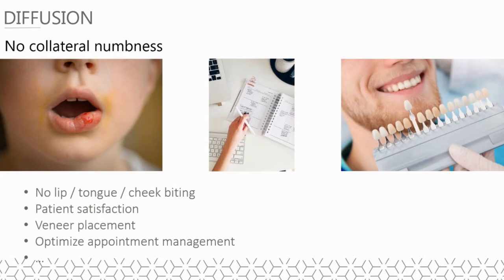You will gain in customer satisfaction, as they will leave the practice and be able to proceed with their everyday activities without the handicap of a baggy lip for 3 to 8 hours. For your aesthetic treatments and veneer placements in particular, the patient will not lose function of their lip, enabling you to easily assess the smile line for a perfect result.